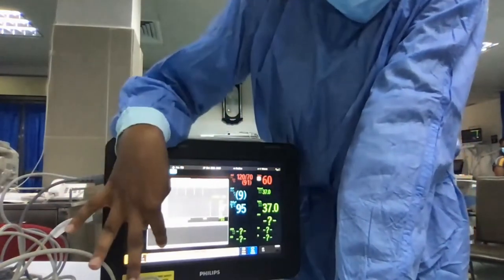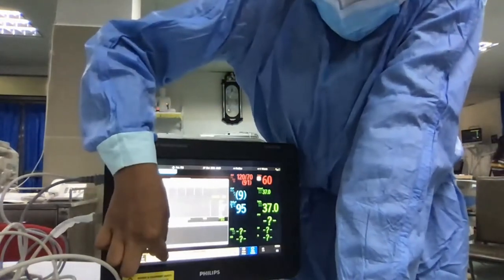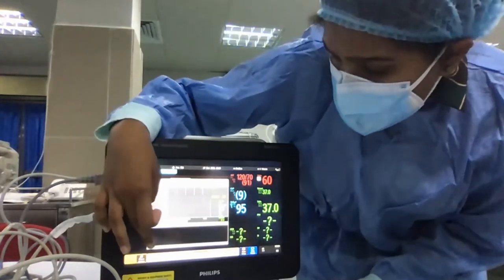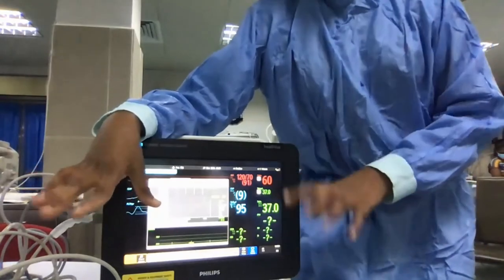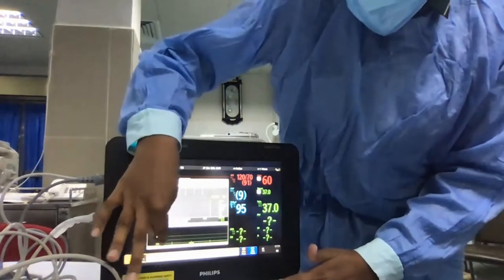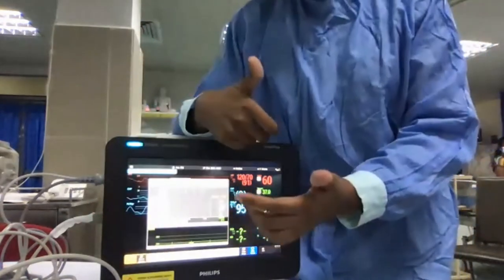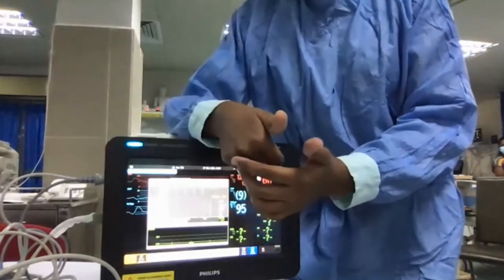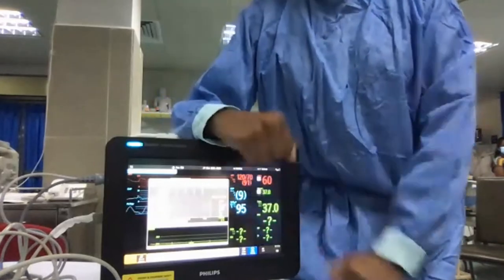Then here, press start cardiac output. Then it will show stable baseline, inject now. So wait for that message. Just don't inject right away, wait for the signal. When it shows stable baseline, inject now, then you can inject the cold saline steadily without any jerks within 5 seconds to the patient. Just don't hurry, just smoothly inject within 5 seconds.